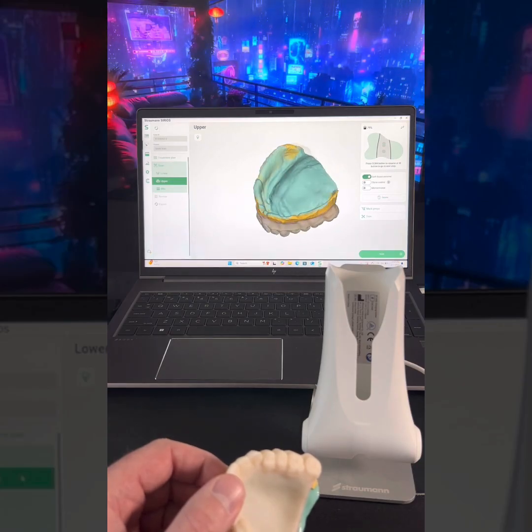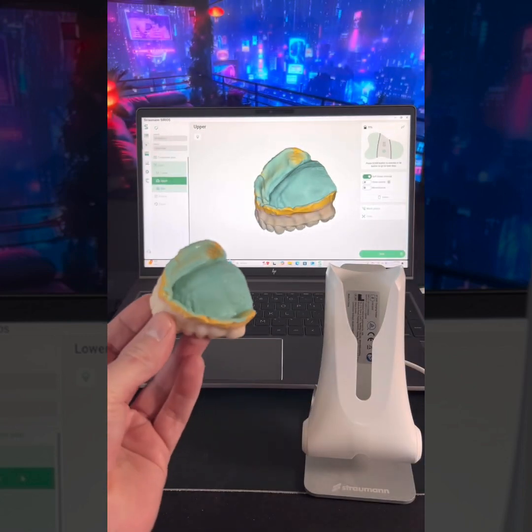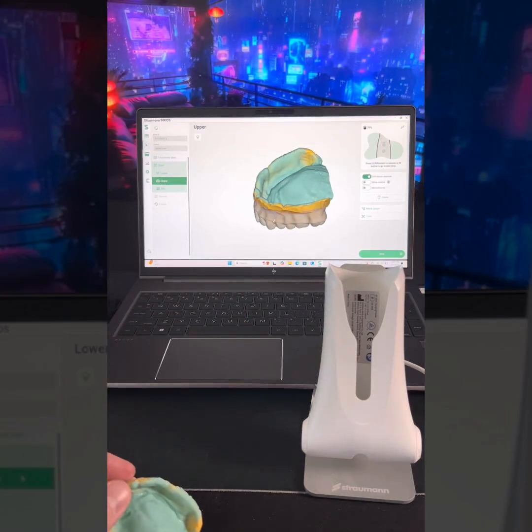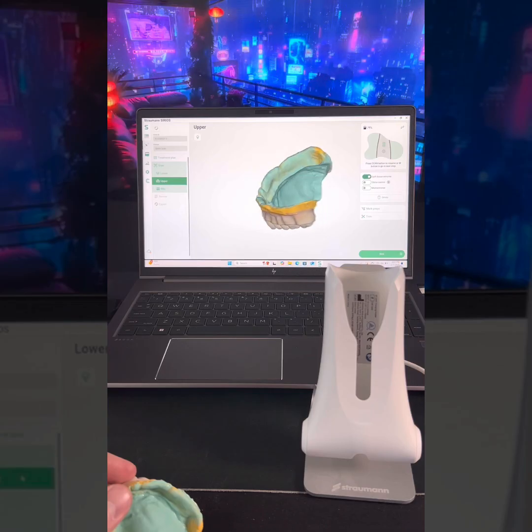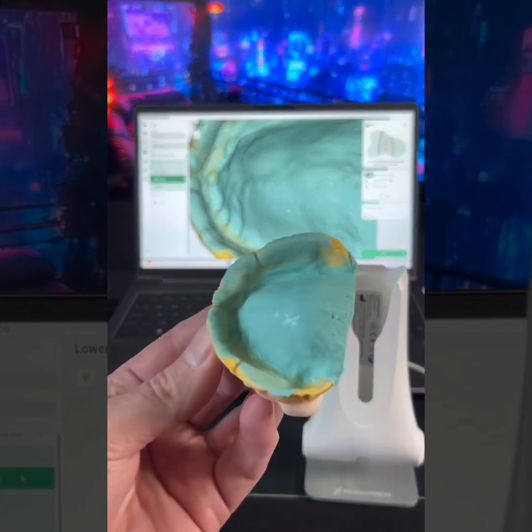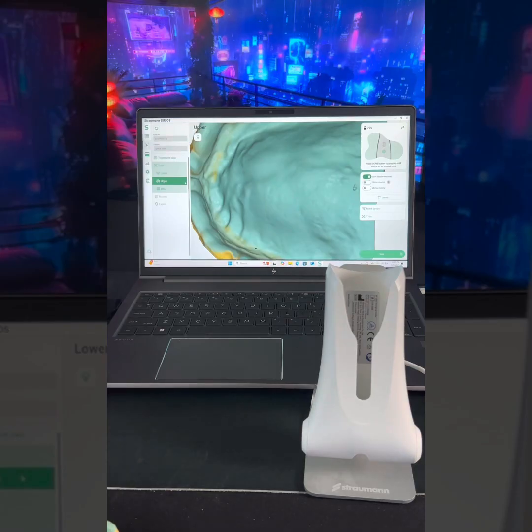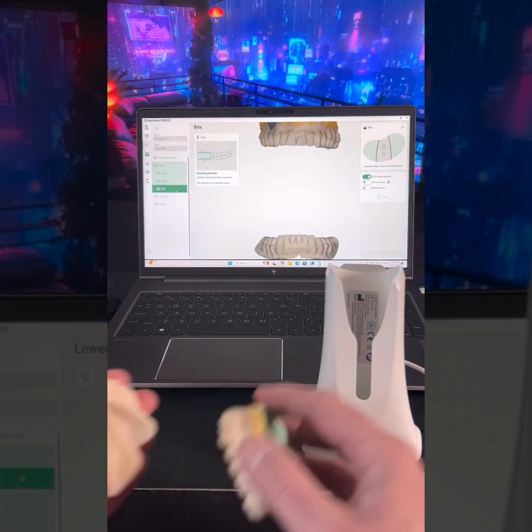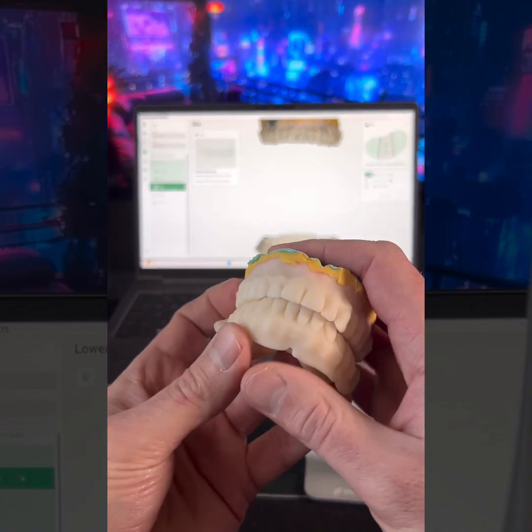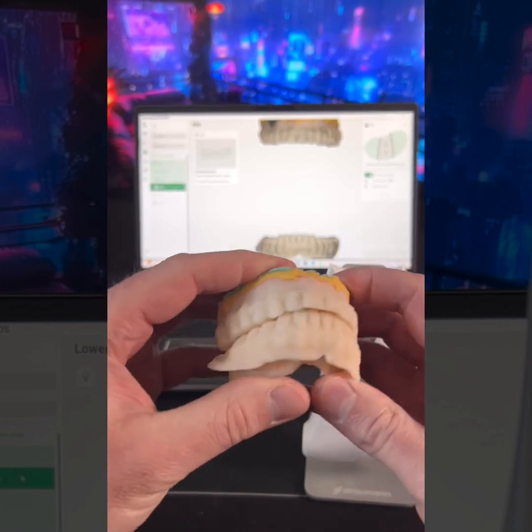So let's look at this and see how we did. I like it. Not bad. Zoom in on these undercuts to see how well we did. There we go. Let's do the bite. I don't have a model with this, so I'm going to do my best. It's close enough.